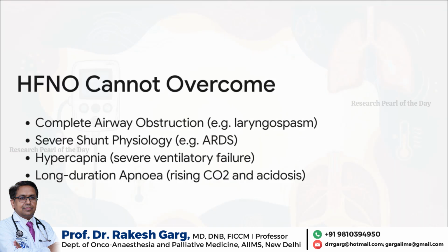As amazing as this tech is, HFNO is not magic. There are hard physiological walls it just can't break through. No matter how high you crank that flow rate, it's completely useless if there is a complete airway obstruction, like a bad laryngospasm, blocking the path to the lungs. It also can't fix severe intrapulmonary shunting, like you'd see in massive ARDS, where blood is just bypassing functional alveoli entirely. And as we just established, it absolutely cannot save a patient from severe ventilatory failure if apnea goes on for so long that they develop life-threatening acidosis.